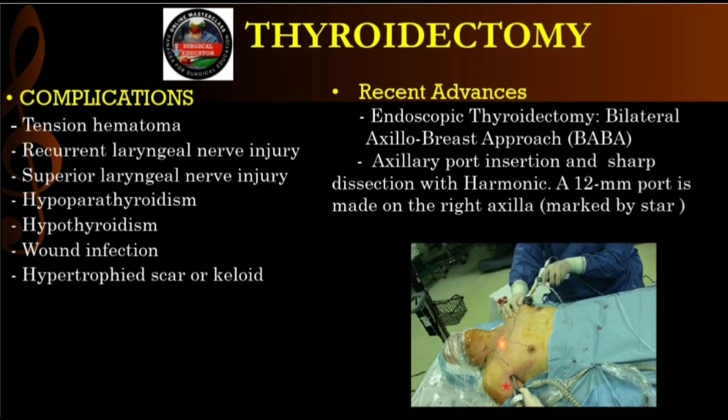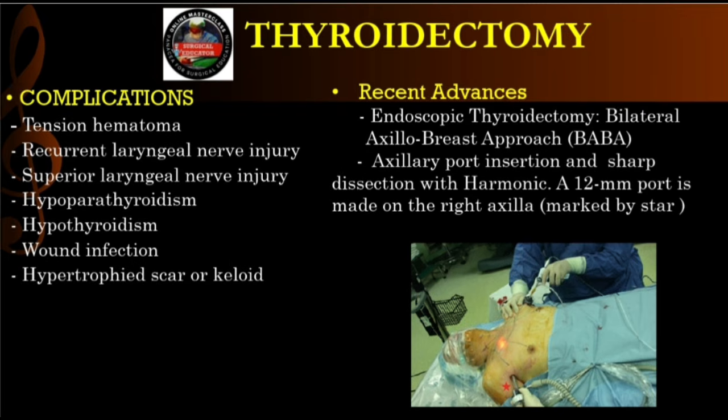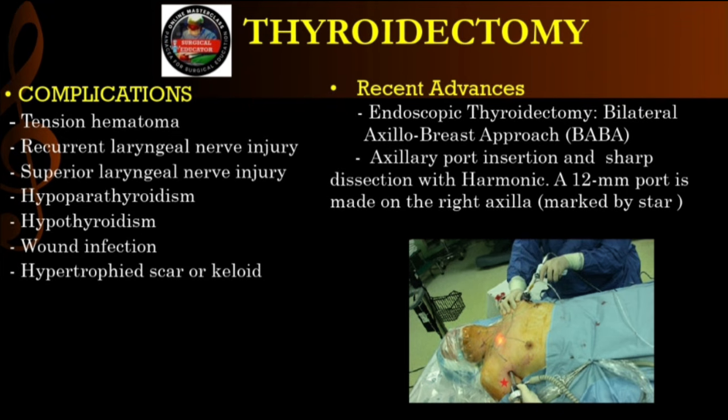If I get a hematoma in my leg, it just bruises. Why is the neck so lethal? Because the anterior neck is a sealed box, bound by tough fascia in the back, and the heavy strap muscles we literally just sutured shut in the front. That's locked. Right. So if an arterial knot slips in the recovery room, high-pressure blood floods the box. It can't expand outward. So it pushes inward, directly into the trachea.